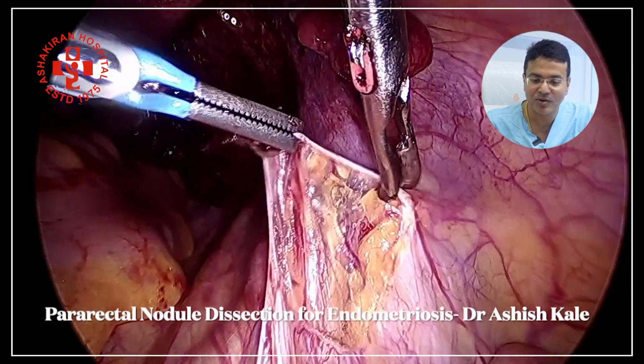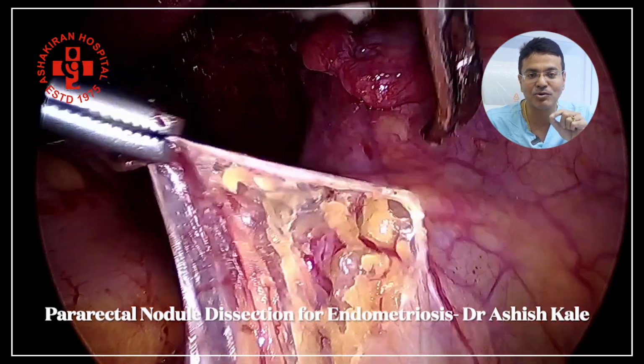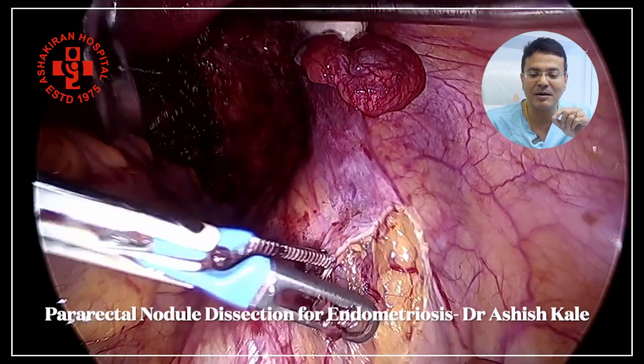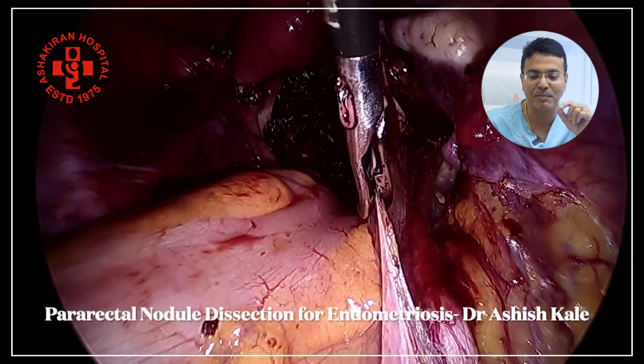You can see one thing we need to understand: we have to be parallel to the tubular structures. Once we are parallel to the tubular structures, usually blood loss will not be there. We are in a proper plane.